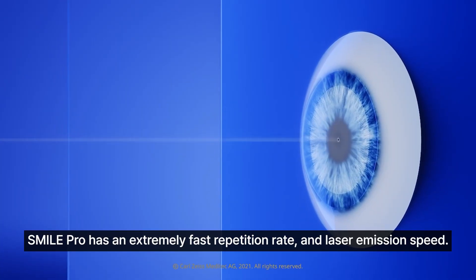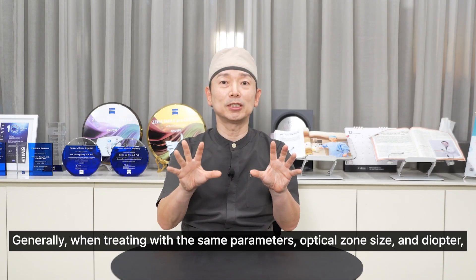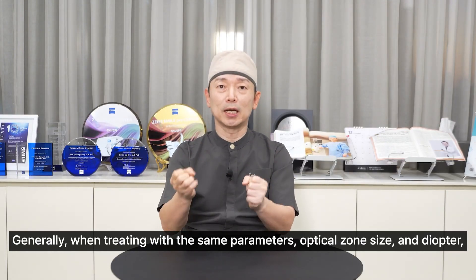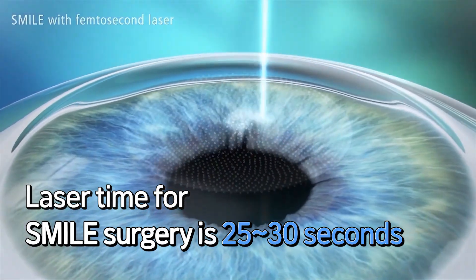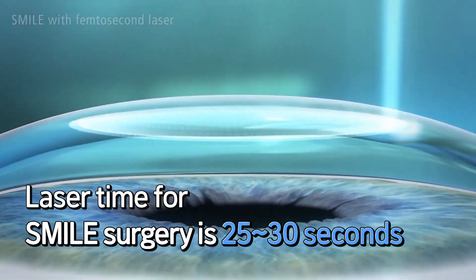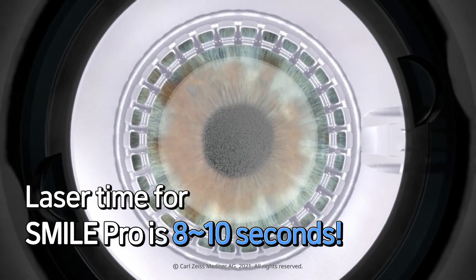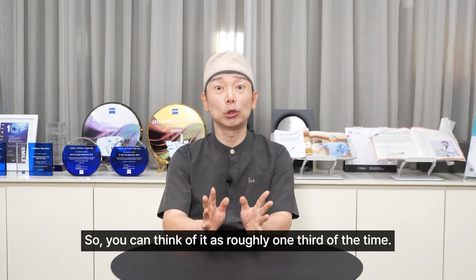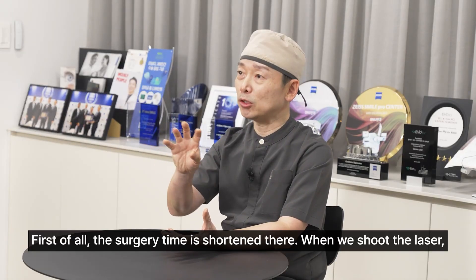SmilePro has an incredibly fast repetition rate and laser emission speed. Generally, when treating with the same parameters — optical zone size and diopter — Smile takes about 25 to 30 seconds of laser application time. In contrast, the Visumax 800 SmilePro only takes about 8 to 10 seconds, roughly about one third of the time. So first of all, the surgery time itself is shorter.